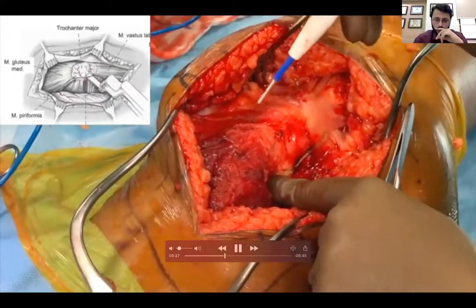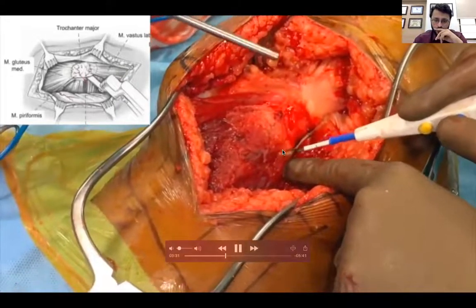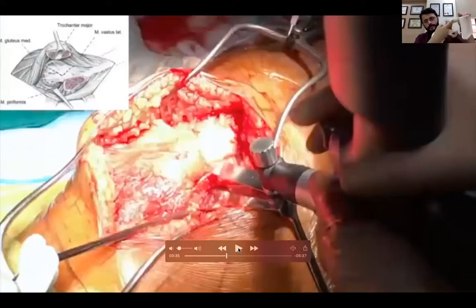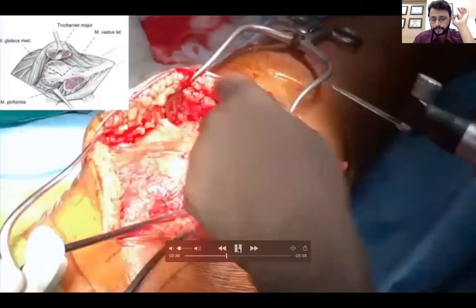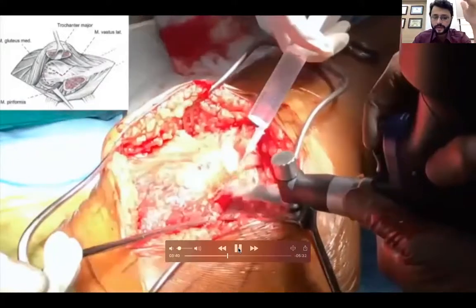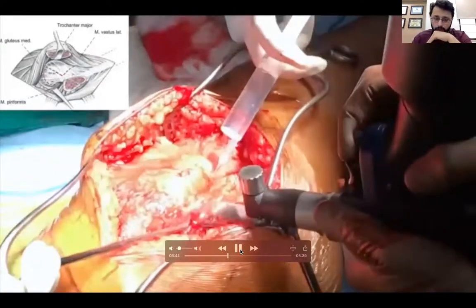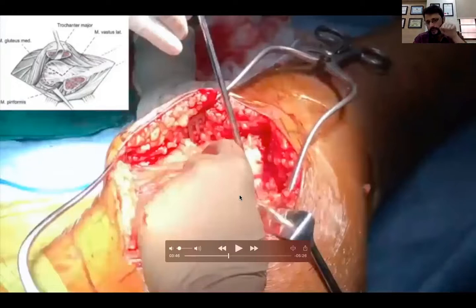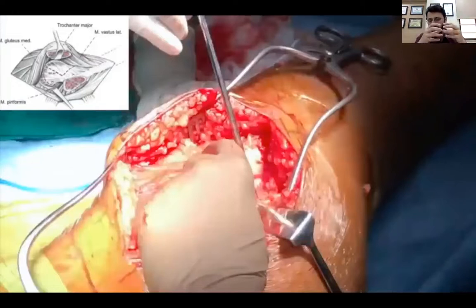Starting from just at the axilla of this gluteal sling, extending right up to the tip of the trochanter. Right? So always remember there is this cut which is going to go from the base of the shaft here right up to the tip of the trochanter, so that a few fibers of the gluteus medius are going to be cut. But it is always important to remain on the G med side rather than the piriformis side. Now, as you can see, my direction of the saw is slightly posterior initially. That is because the entire hip is directed externally, with an external rotation in SCFE. So it's very difficult to go absolutely parallel to the shaft.